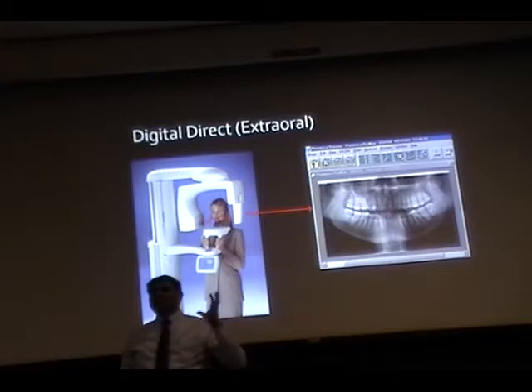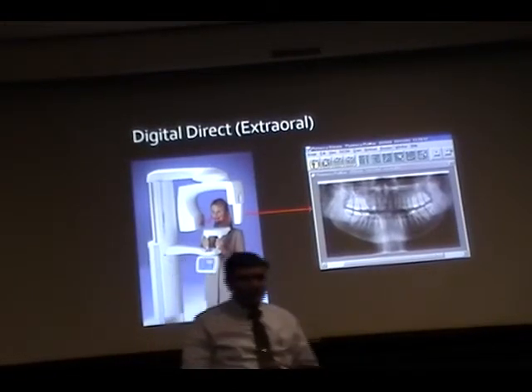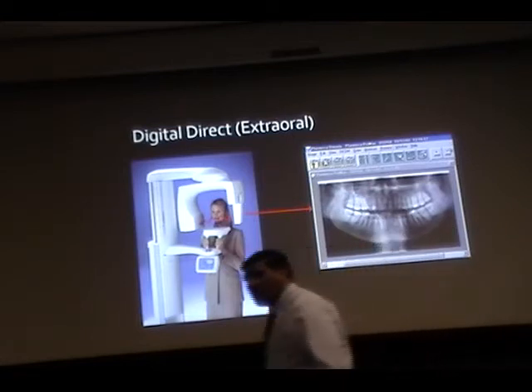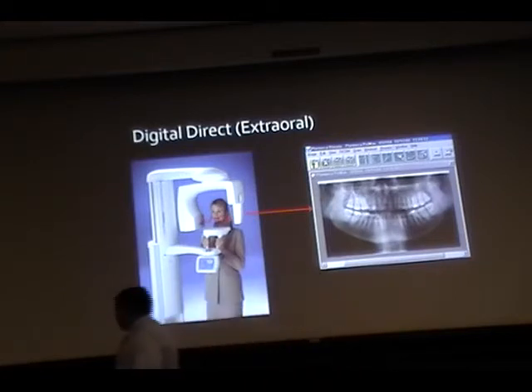What is happening to the X-ray source? Let me rephrase that question. Do you have to give more radiation or less radiation if you are using flat panel detectors? More radiation. Why? You need more photons to get there. Yes, you are right.